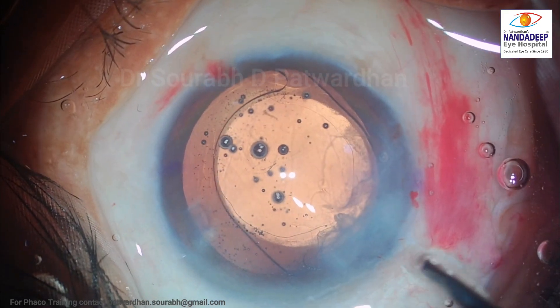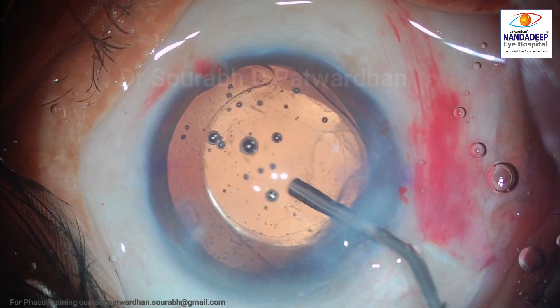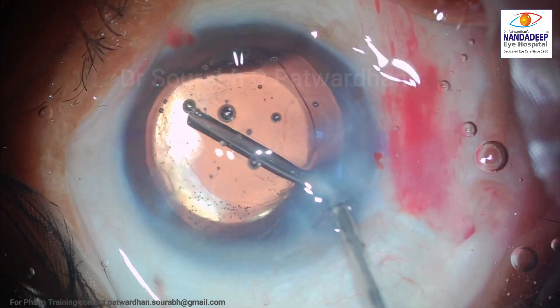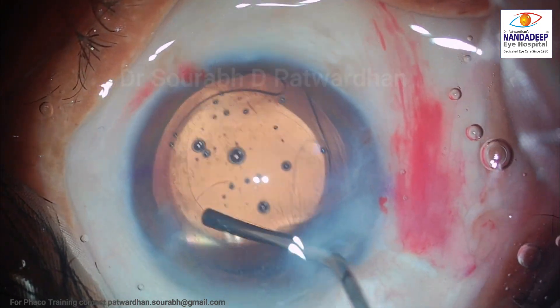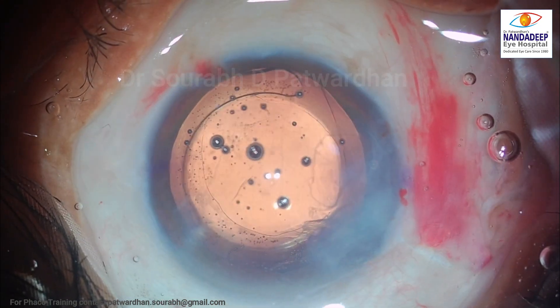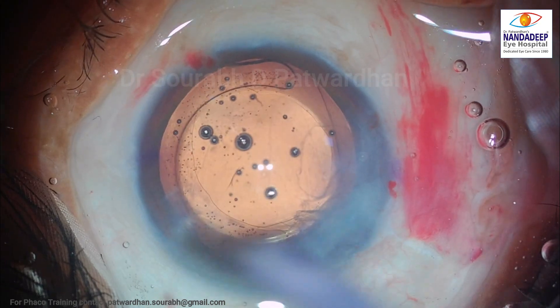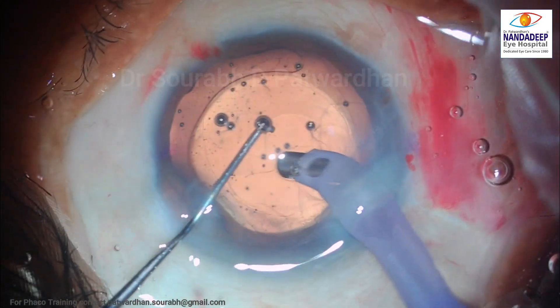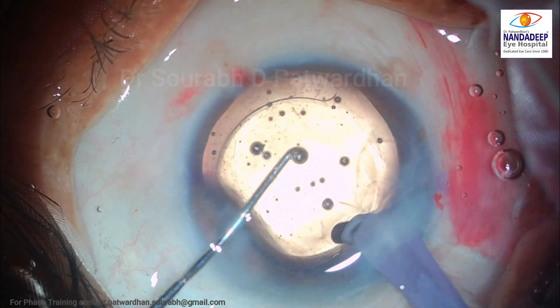Once it reaches the equator, I will push with some visco and then rotate the IOL in such a way that the haptic starts rubbing the sub-incisional cortex, so it gets loose and I will be able to remove it with my coaxial IA probe.